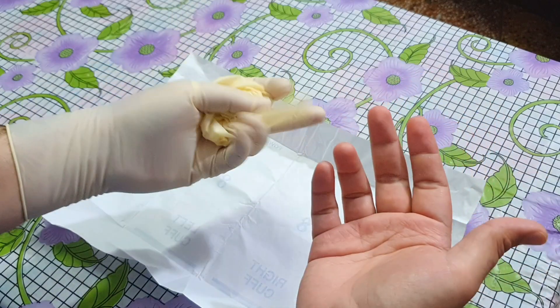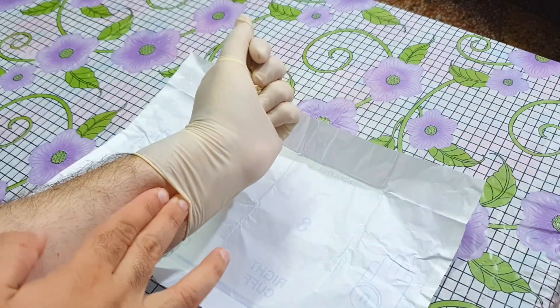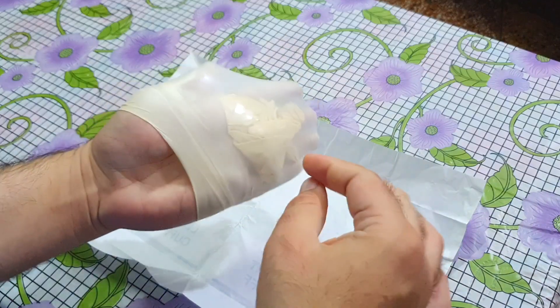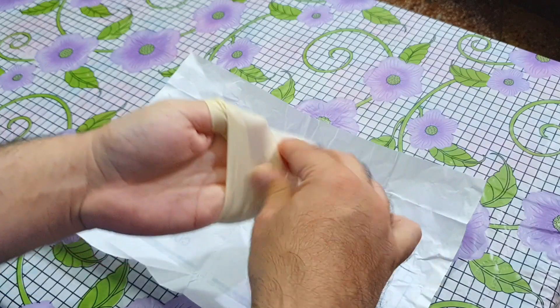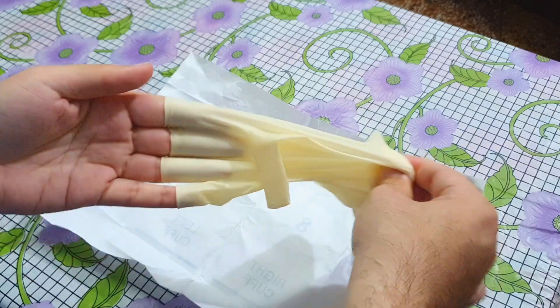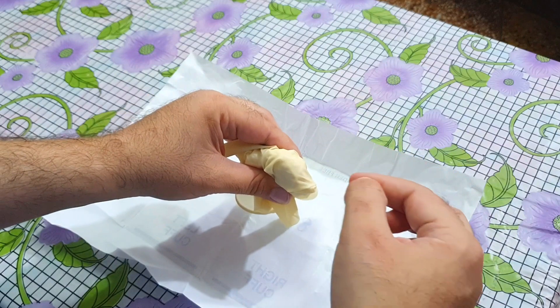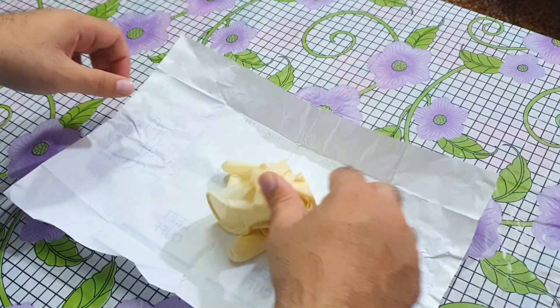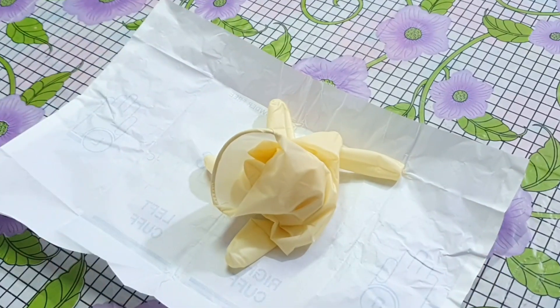Hold the dirty glove in the other hand. Now slide your fingers inside the other glove and remove it like this. The other glove also becomes inside out while removing. In this way you can remove both dirty gloves without touching their outer dirty surface. After removing the gloves, discard them in the proper place.